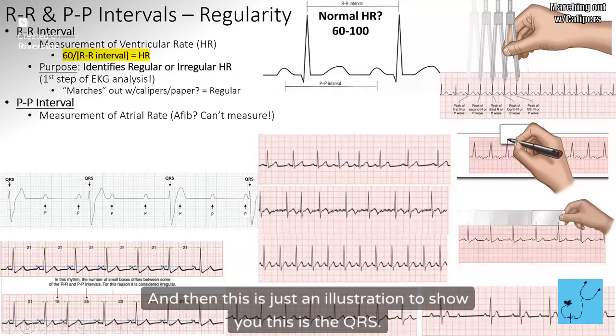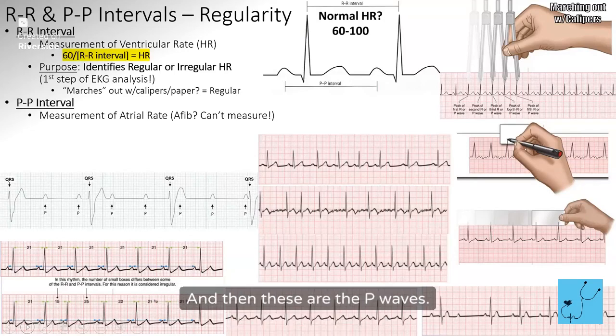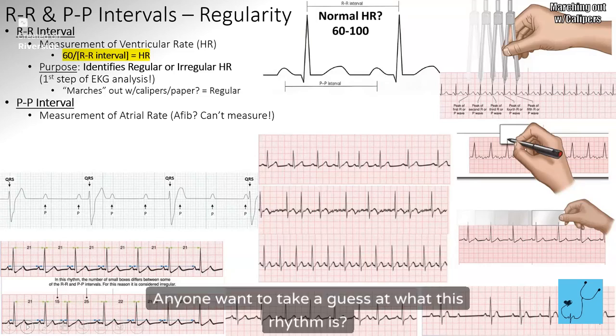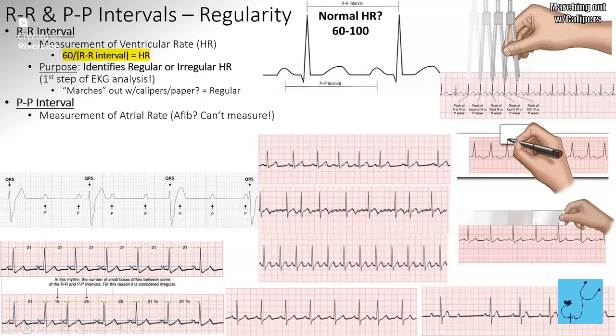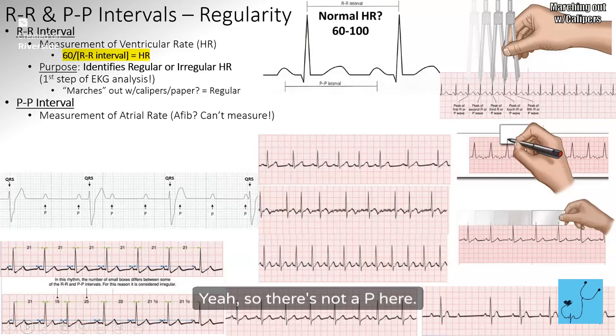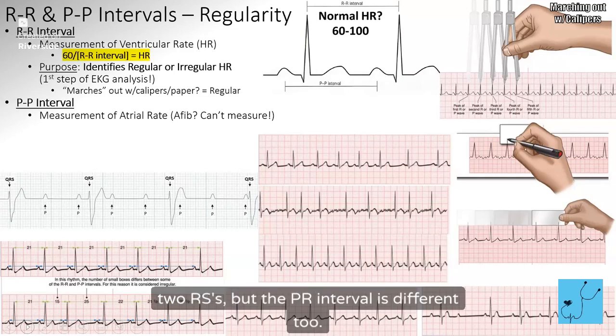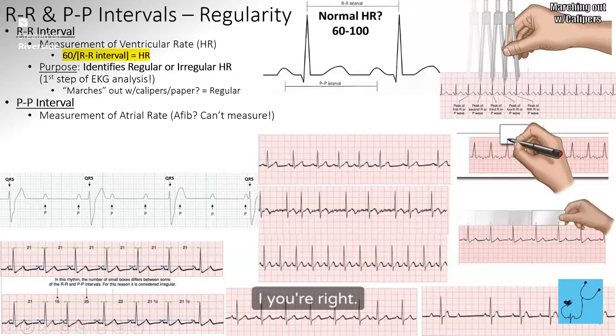And then this is just an illustration to show you this is the QRS, and then these are the P waves. Anyone want to take a guess at what this rhythm is? So third degree, yeah, so there's not a P here. We're randomly dropping QRSs, but the PR interval is different too. So yeah, I think it's a third degree. I think you're right.